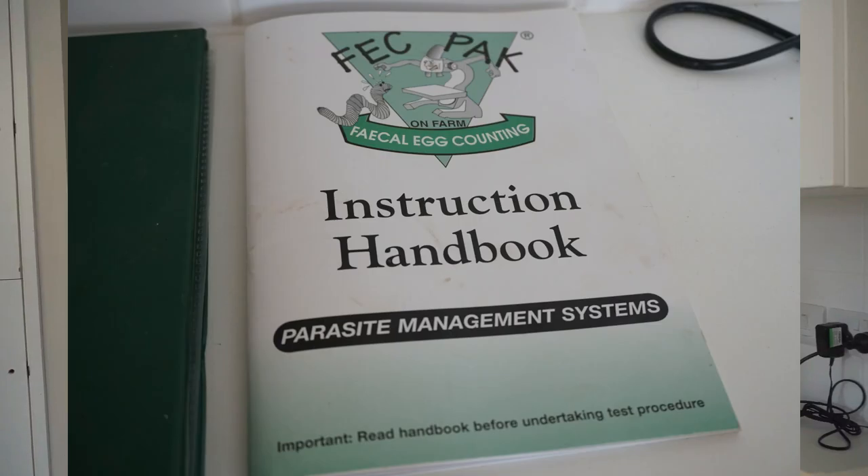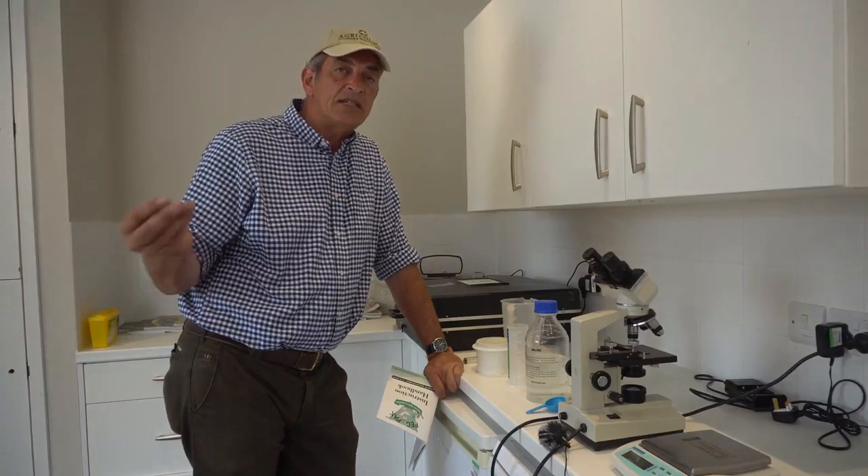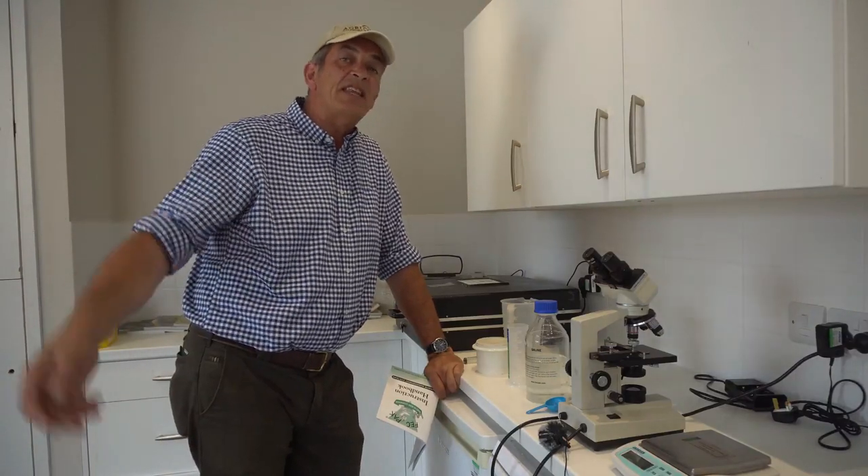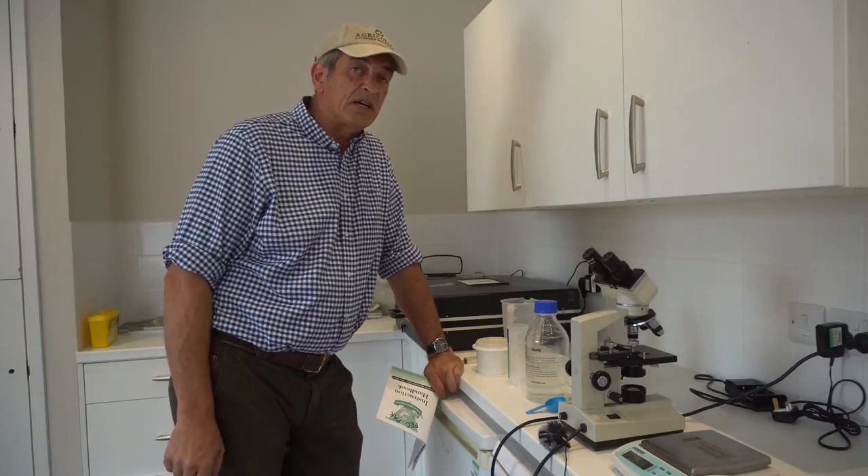It's a very simple system and it's called FECPAK. Some of you may be aware of it, and a lot of you will take samples to a vet for analysis to tell you which worms are burdening your sheep, or if indeed there is a burden from those worms within the gut.